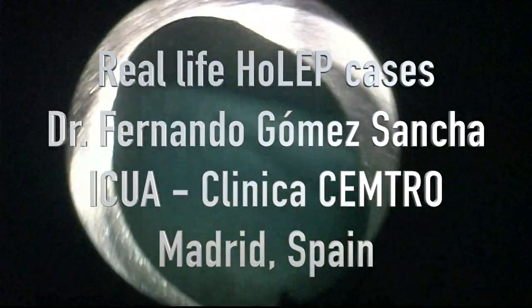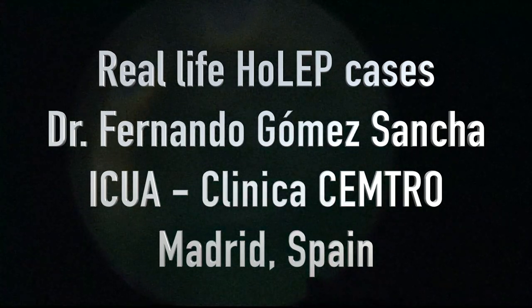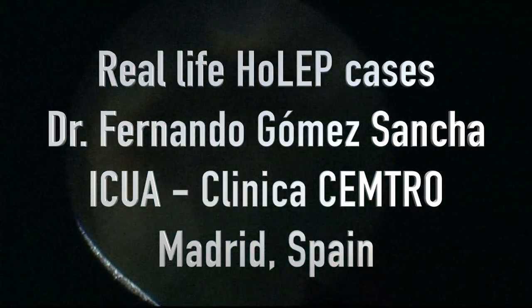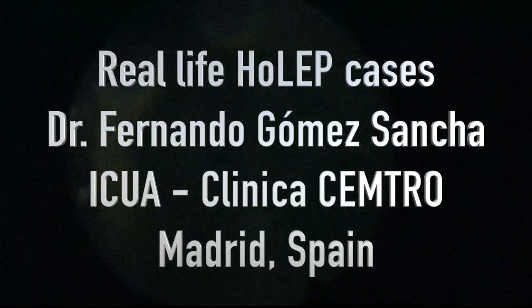I did a lot of green light vaporizations in the past, and with green light it was possible to do the operation almost alone. But with HoLEP you need a lot of help. We have the morcellator prepared here, and of course the surgeon is going to perform the operation, but the support of the nursing staff is very important.